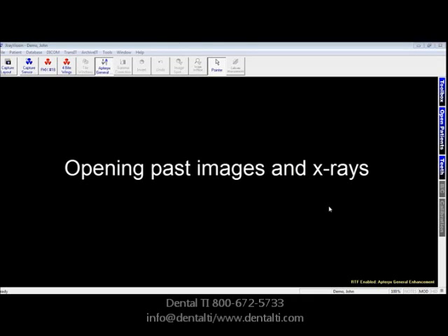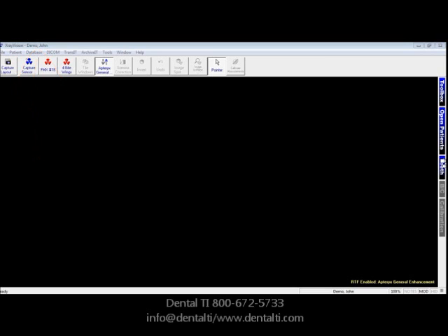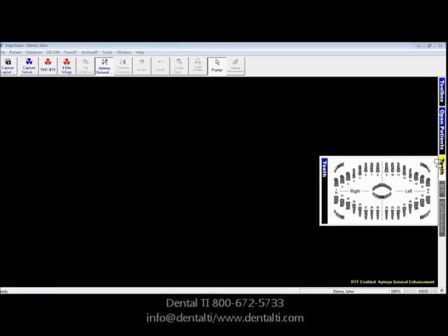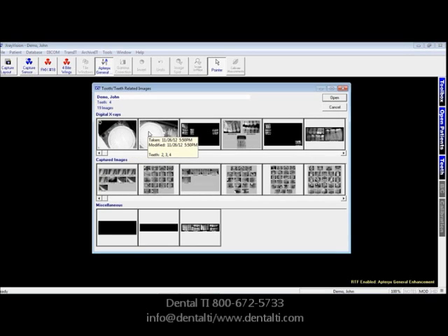Opening past patient images in X-Ray Vision. Here we verify that the patient is open — John Demo on the title bar of X-Ray Vision. Then we can go over to Teeth. When we click on Teeth and click on any of the teeth numbers, for example 4, it will show every layout or individual image that is labeled with tooth number 4.